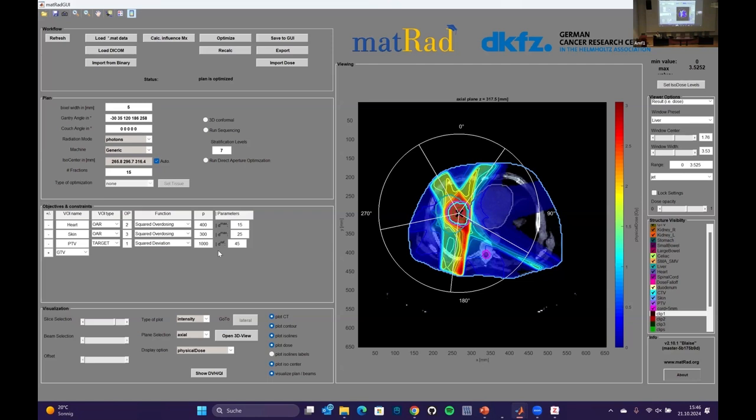with the same amount of planners or have fewer planners. So this is where a lot of research went in the past: automating this tweaking process. It's still not perfect. You still need to do tweaking, but nowadays you can do it in clinical systems quite fast. Same with the contouring question. Tedious tasks that have a solution can be automated in some form.